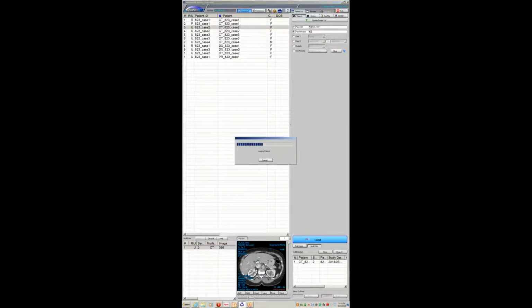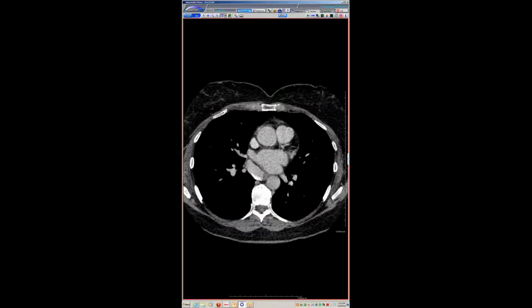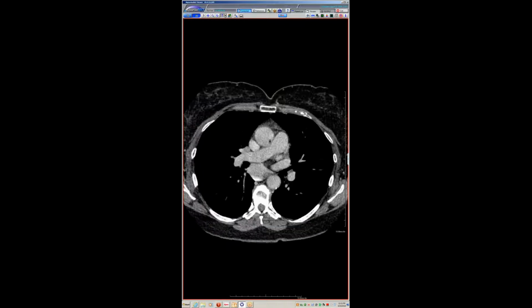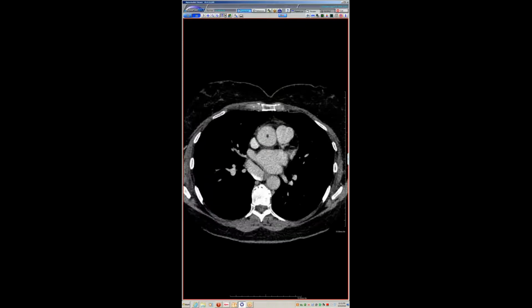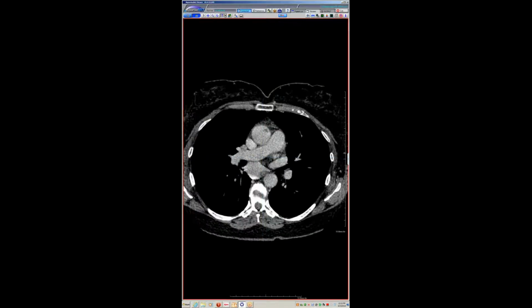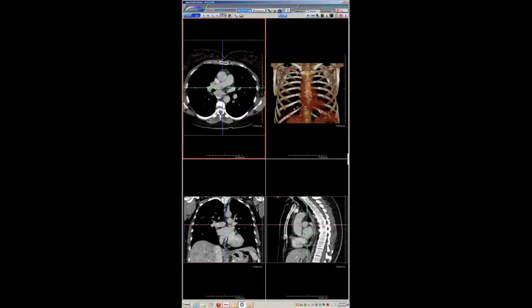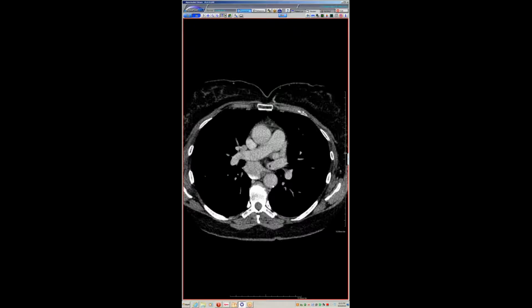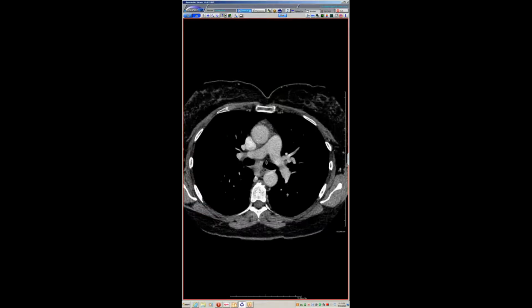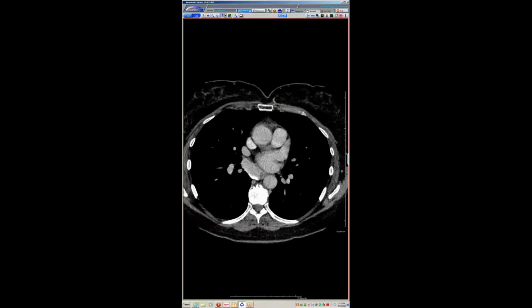Yes, exactly. Here's a case that was interesting because people here got fooled by it because of the phase of contrast. This was a patient who came in, I can't remember the exact reason, and had a contrast enhanced scan, and you can see this very classic subcarinal mass. It's well defined, with very smooth edges. When I say smooth, I should say deformable edges. Unlike that last study, where the aneurysm was displacing the heart and other mediastinal structures, this is conforming to the underlying mediastinal structures.